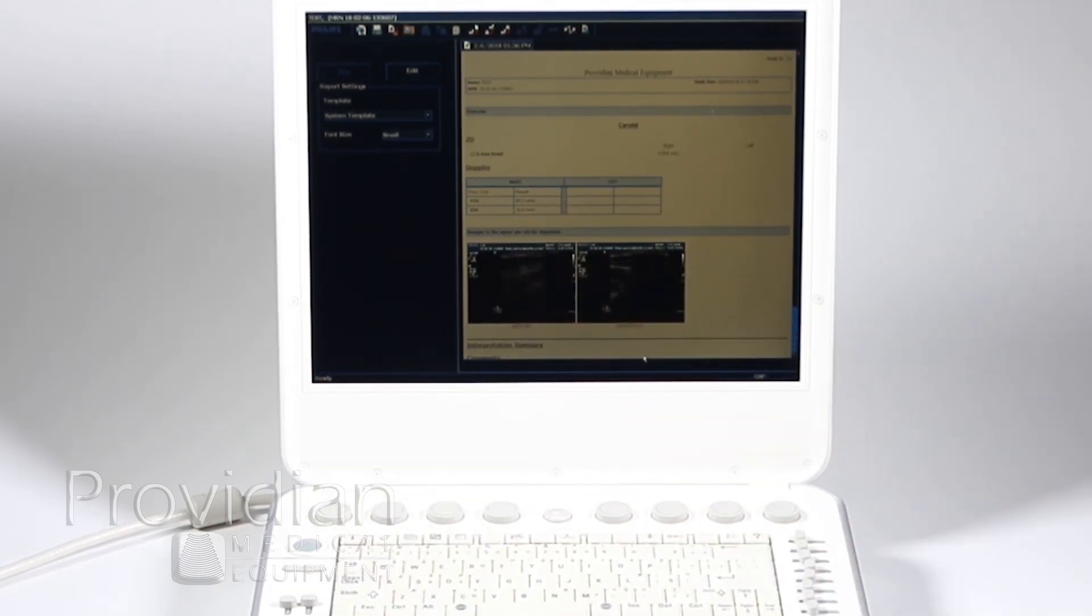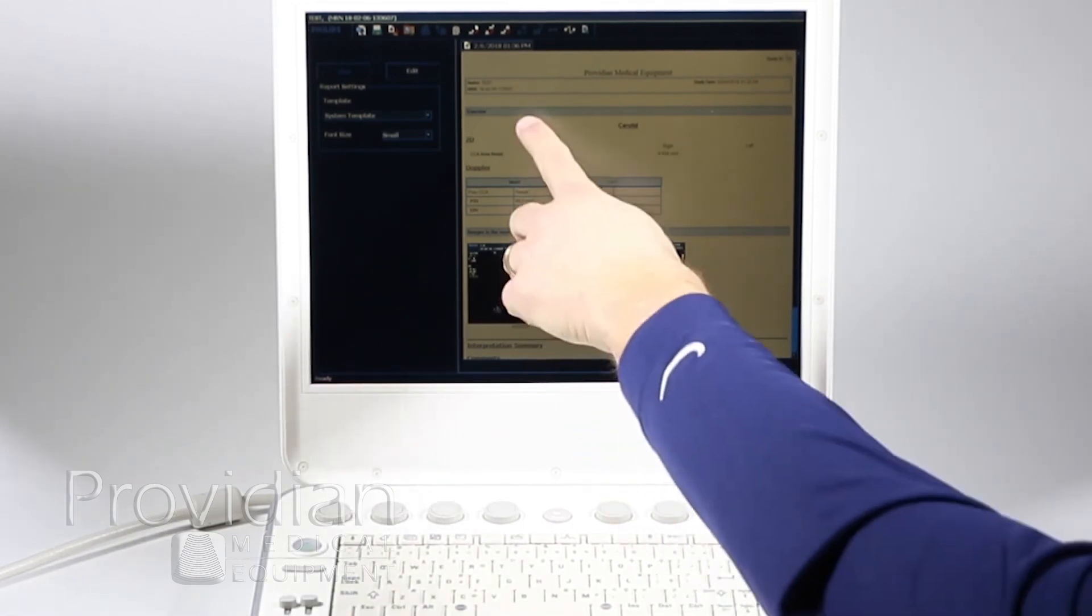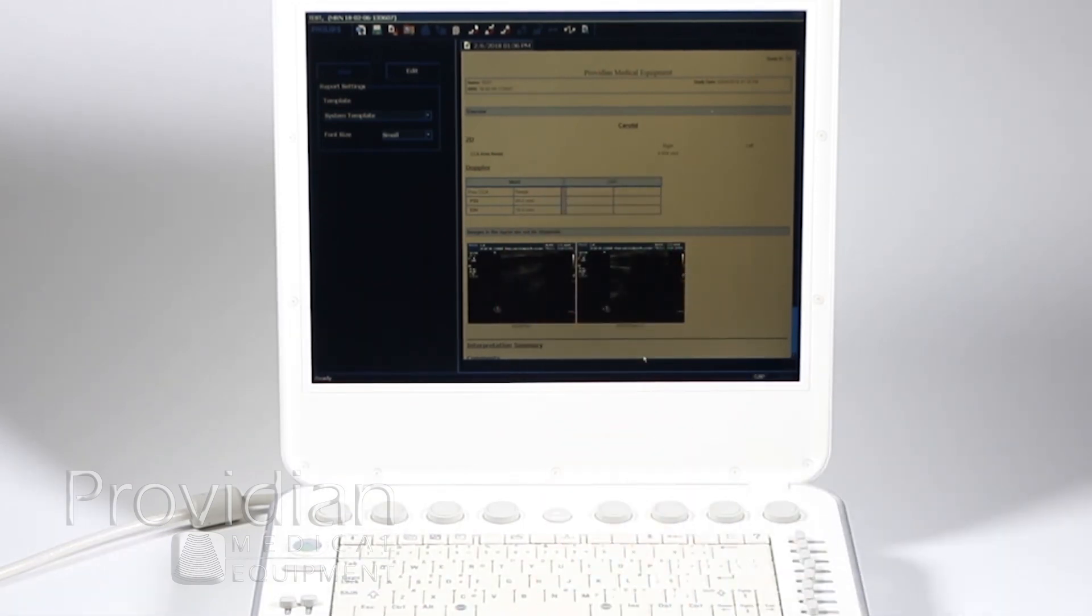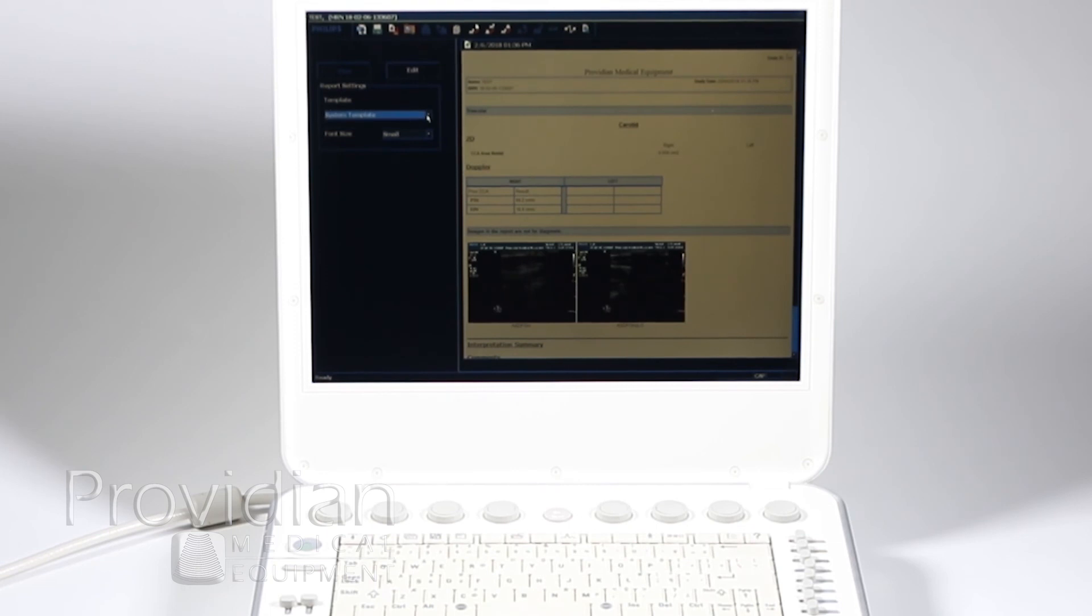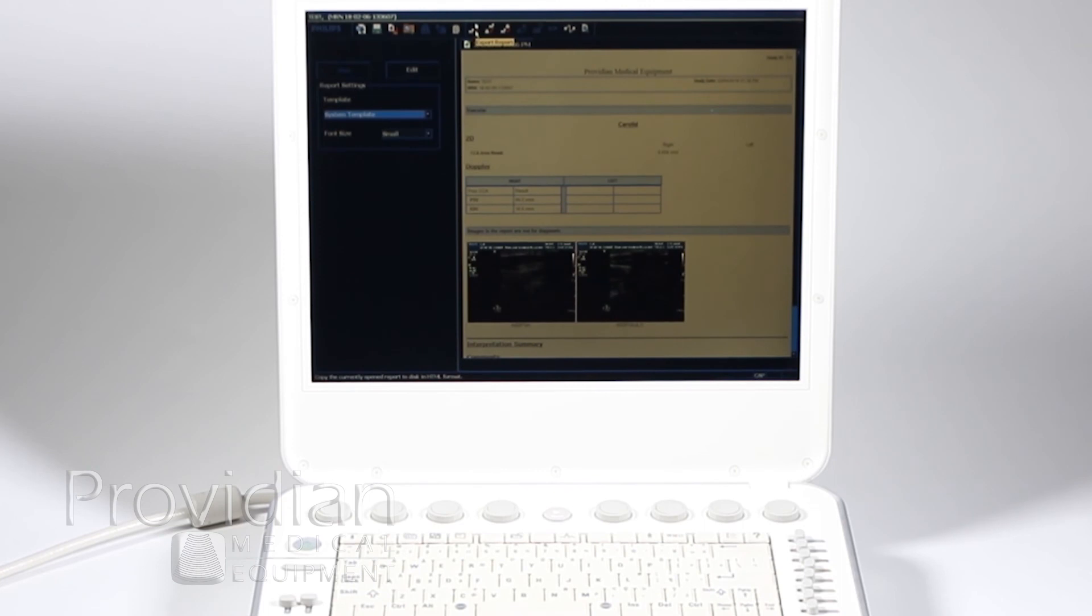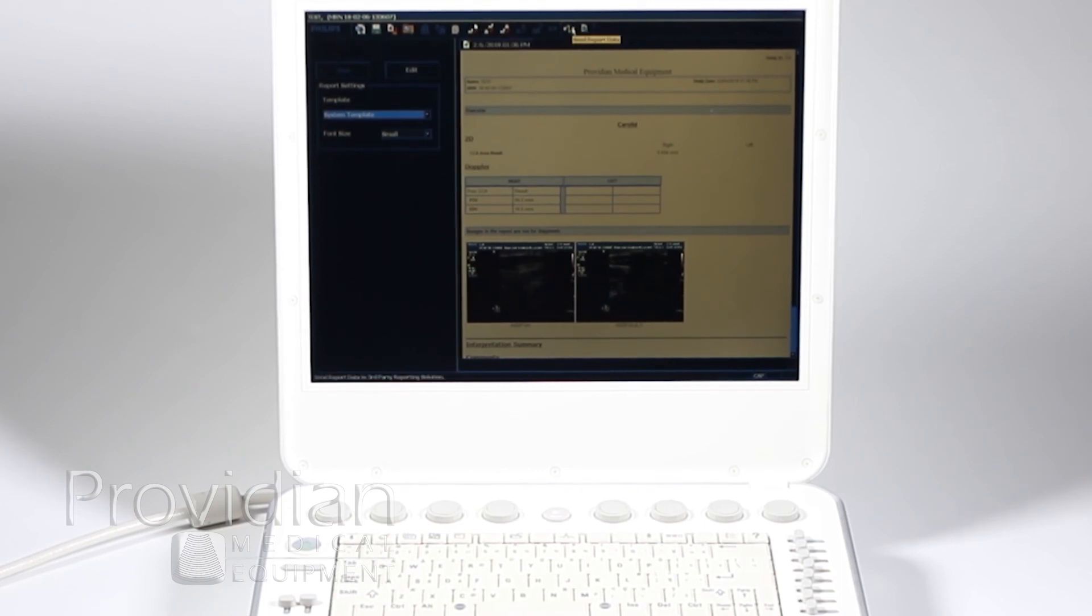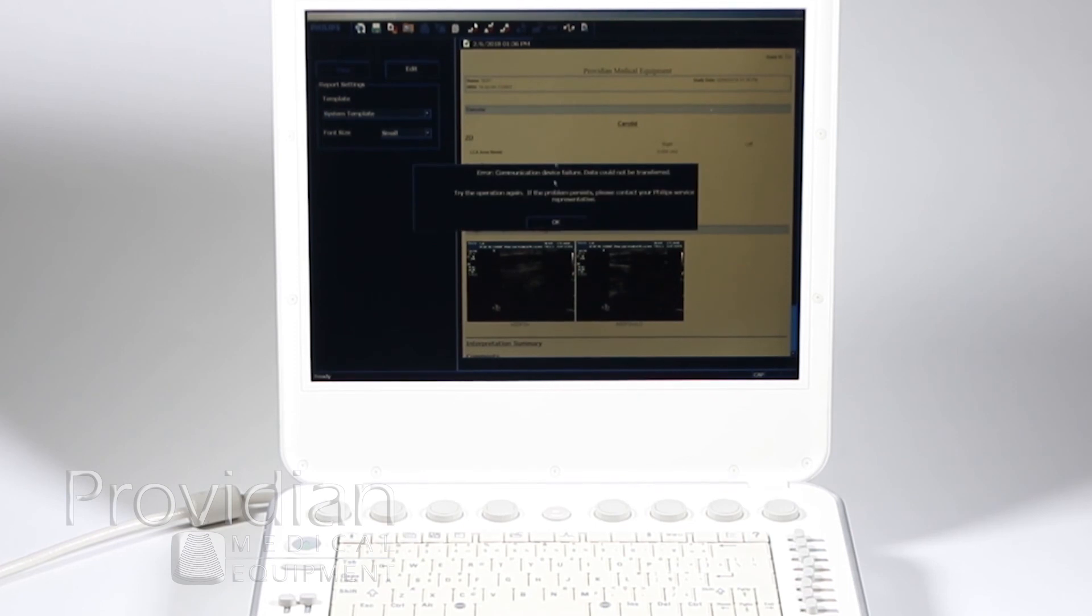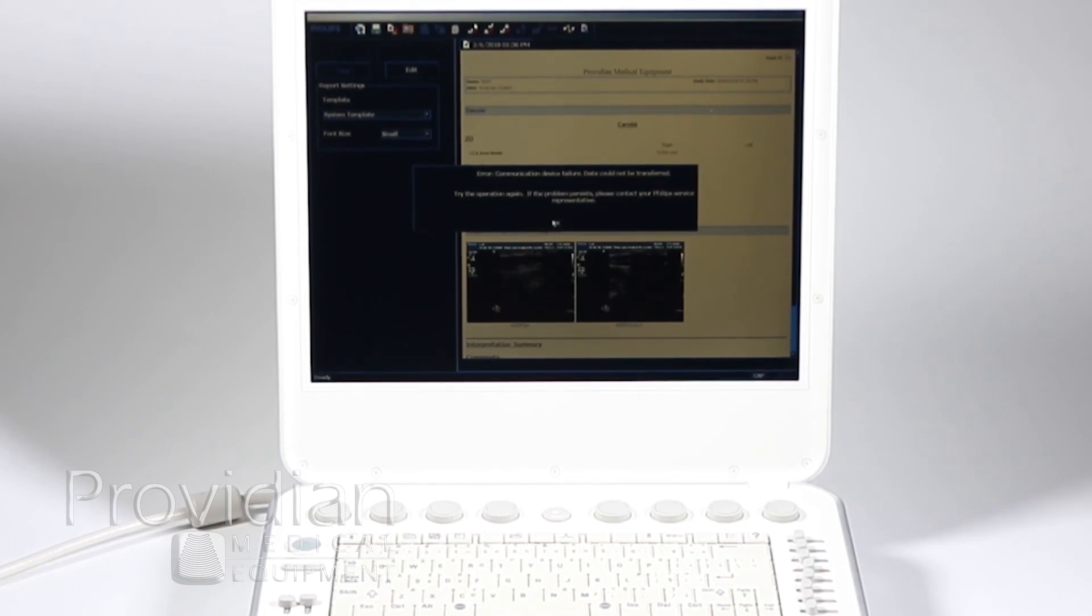You can change your templates if you create your own. You can edit the template, and here you can also export that report to DICOM. Here you're going to say Send Report Data, and that's where you're going to go ahead—that's not set up right now, I don't have my system connected to a network, so it's not going to be able to transfer.